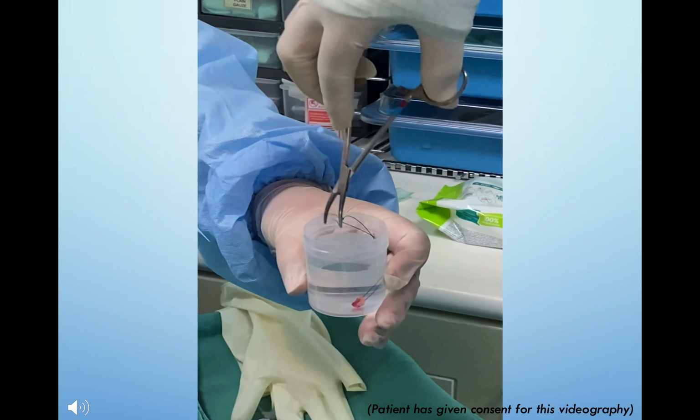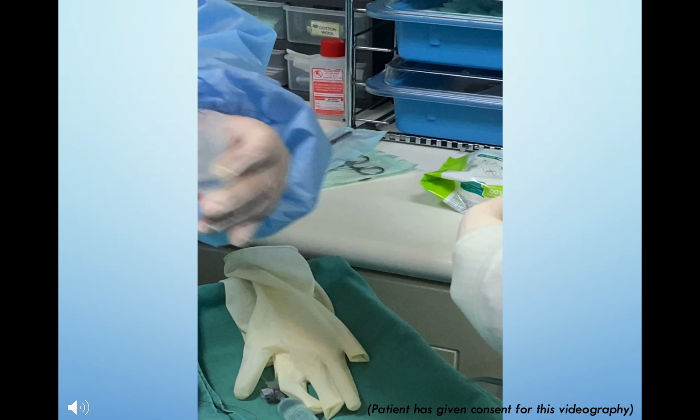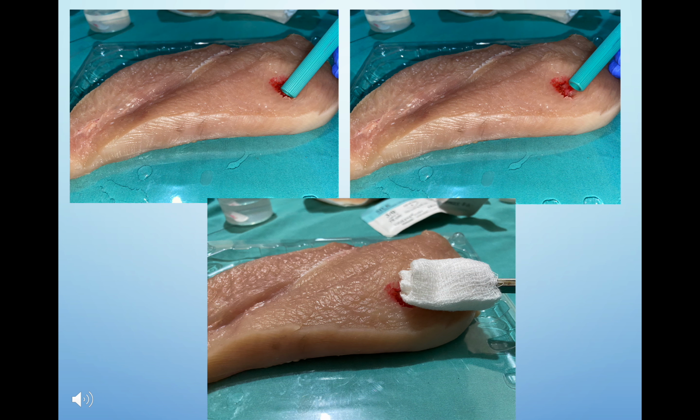Then the specimen is placed into the formalin, and please do not reuse the instrument if it has been in contact with the formalin. As mentioned just now, do not place the suction tip directly at the base of the biopsy, but just place it at the surrounding area. Alternatively, you can also use a gauze to stop bleeding.